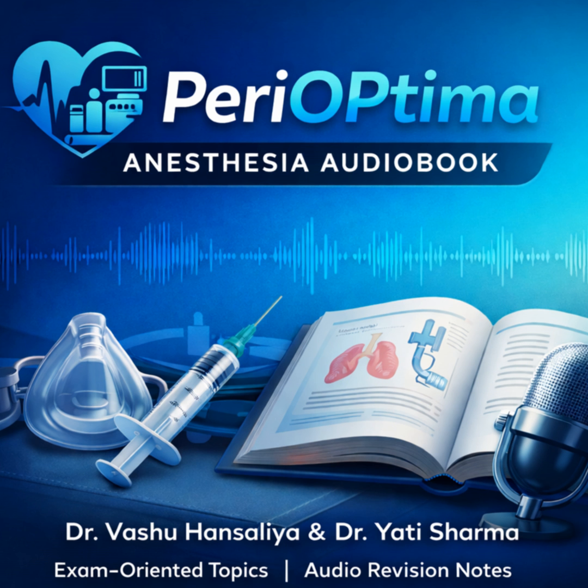So let's dive into Section 1, Introduction. Why are we even talking about this? What's the role of mechanical circulatory support in the modern context? Well, historically, if a patient's heart failed, say, after a massive heart attack, and you hit the pharmacological ceiling, meaning you're on max doses of adrenaline, noradrenaline, max everything, that was it. The mortality was effectively 100%.